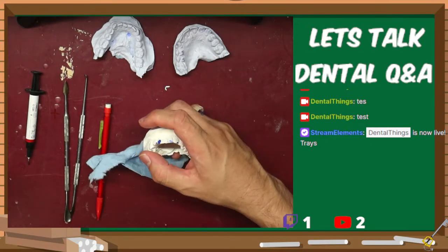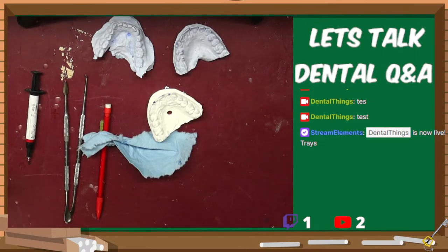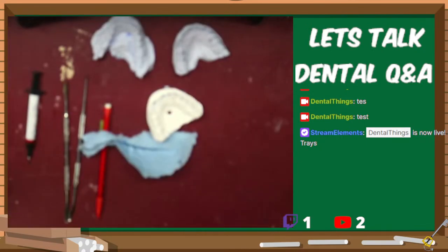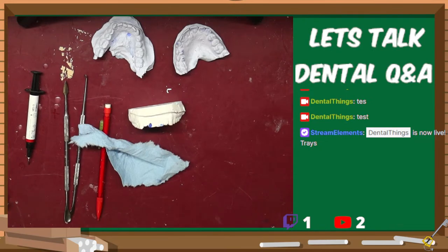Alright, so now we got some of these holes patched. Let's go ahead and move over to my next portion, which is going to be getting ready for my thermal suck down so that we can go and make the next part of the piece. I have water in here. I'm just going to put this over here off to the side for now because I don't need anything boiling. So now let's go from here to actually sizing up what I want to use.